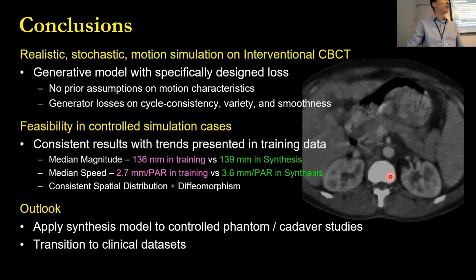For the second question, you mentioned respiratory motion, which you think can better take advantage of 4D CT scans. To answer that, I haven't thought very deeply about that. But for us, in the long-term goal, we want to leverage the power of learning-based methods to actually extract the features from the real data. So I believe the 4D real patient CTs can be a good option.